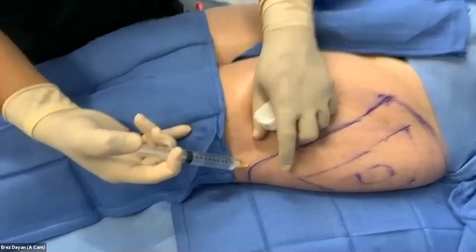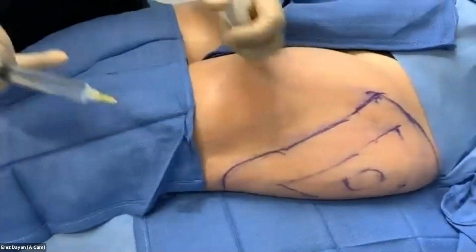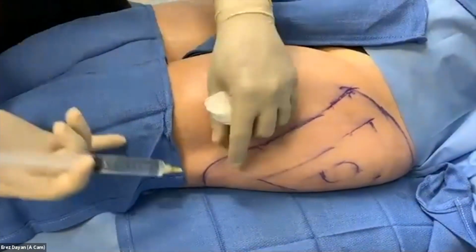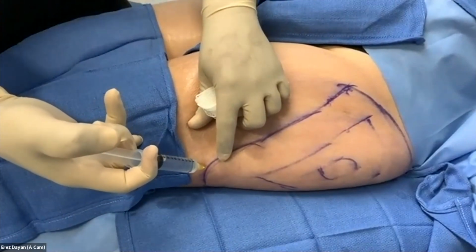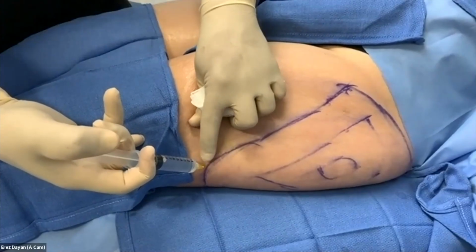So I just slowly infiltrate. The nerves are like a tree, and you have a trunk and then you have branches. So the more superficial you are, the more painful it is. So I don't go right under the dermis. I don't create a bleb. I go just straight down. And you'll see this is my first step. I'm just going to put a couple cc's in here. Just know in your mind kind of where you put that.